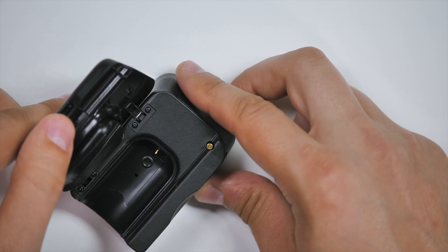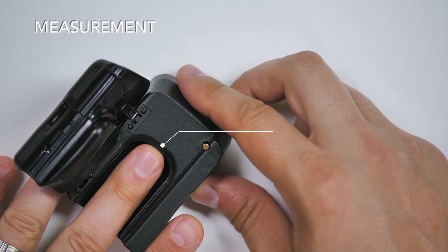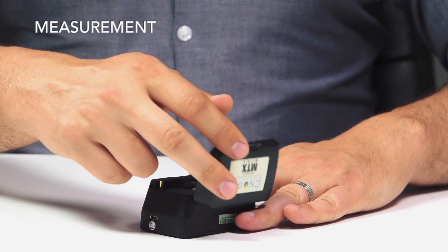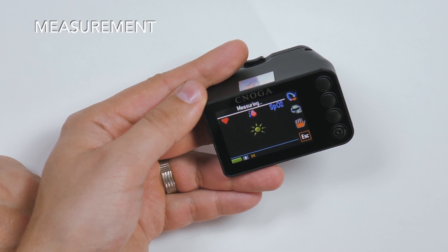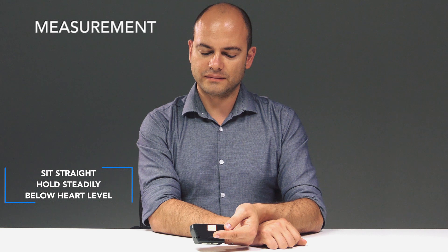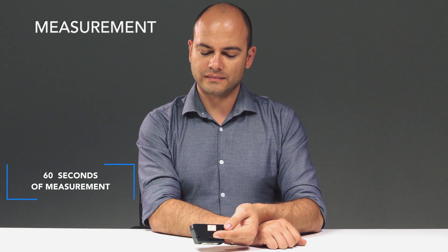Open the lid of the finger chamber and swipe the finger gently down into the finger chamber until you feel the pin. Close the lid and the measurement will start automatically. Support the device to avoid movement during the measurement. Sit straight and hold the MTX steadily on a firm surface slightly below your heart level while the device is facing you. Accurate results require around 60 seconds of measurement.